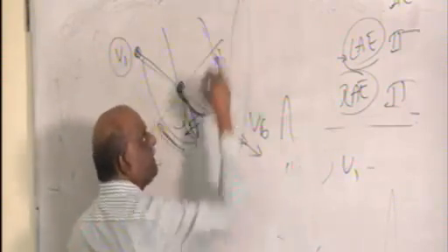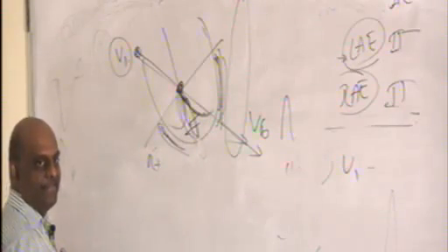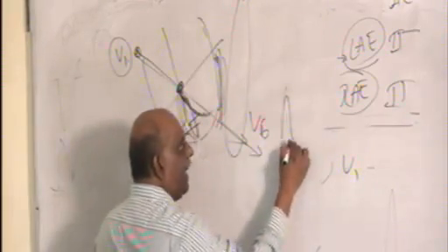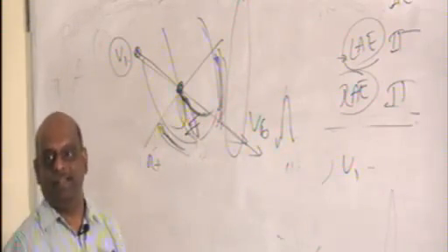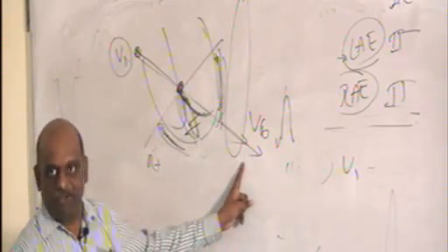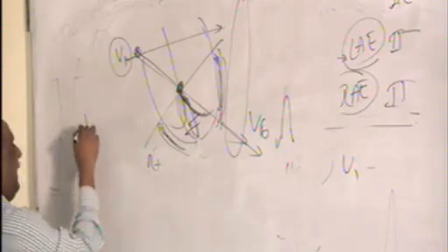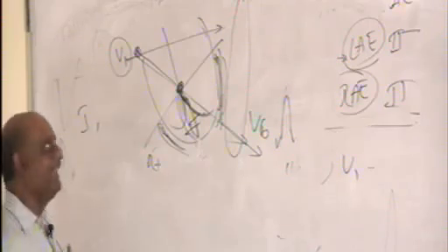In all left sided leads, interventricular septal activity is going from left towards right. In all the left sided leads, before the R wave, you have a small Q wave which is a normal finding. So what are all the leads which are there on the left side? बताओ फटाफट. Lead 1 इसकी दिशा किस तरफ है? लेफ्ट की तरफ. So इसलिए lead 1.